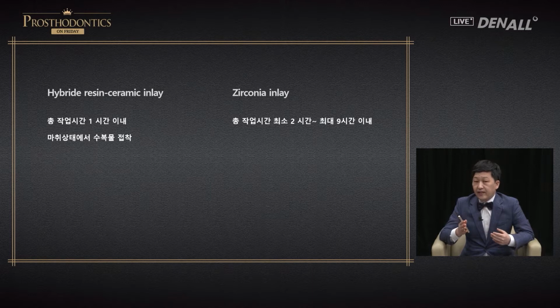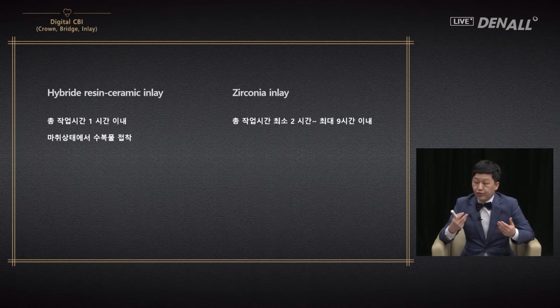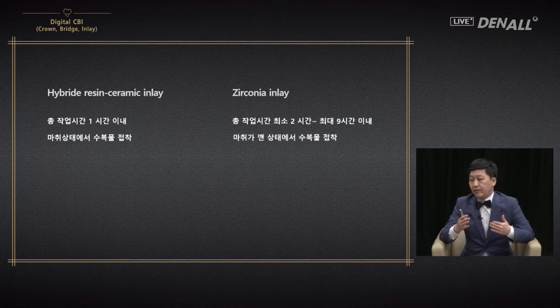When you do hybrid resin ceramic, inlay is attached while the patient is anesthetized, so the patient doesn't really feel discomfort during prep or setting. The biggest issue with inlay is hypersensitivity, and this is significantly reduced because the patient is anesthetized while setting is done. And we can't do this for zirconia because of firing time, and inlay is set after the patient regains all the senses. It has good aesthetics, but in terms of hypersensitivity during setting, it has very little difference with gold inlay. It dampens the advantage of one-day practice.